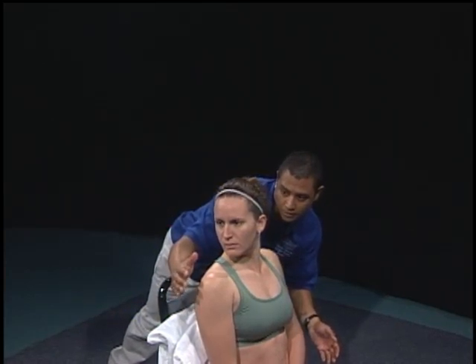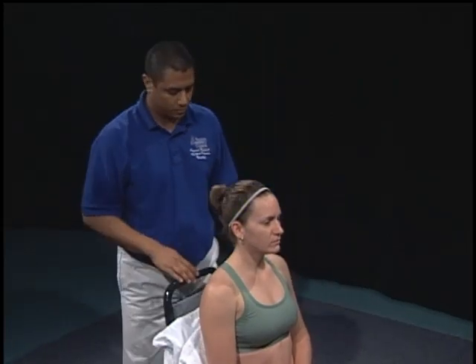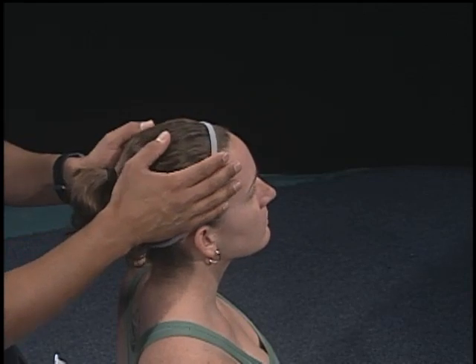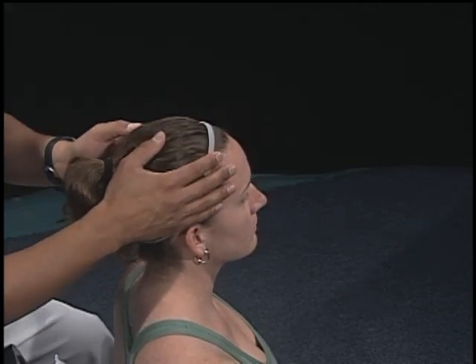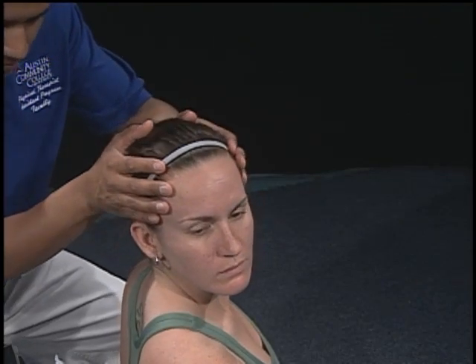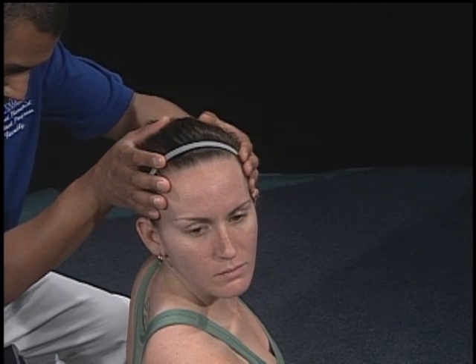The patient may hold a tongue depressor between the front teeth for reference. Standing behind the patient, place your hands on either side of the patient's head above the ears. While watching the trunk for trunk rotation, turn the head with your hands. The end of cervical rotation range of motion occurs when resistance is felt and additional motion causes the trunk to rotate.